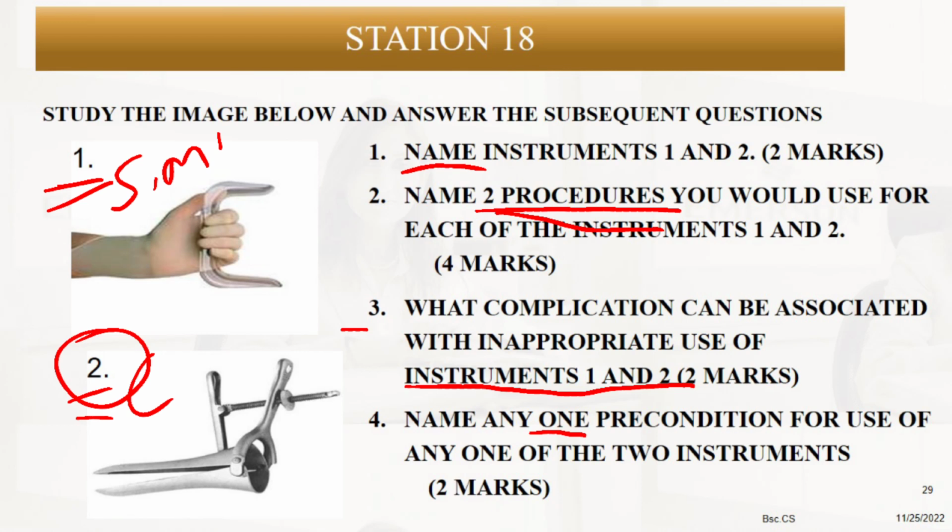Then one precondition for the use of the 2 instruments. Before we start to use those two instruments, you need to make sure that they are sterile. So the one precondition for use of these 2 instruments is that they have to be sterile. That's one of the preconditions.